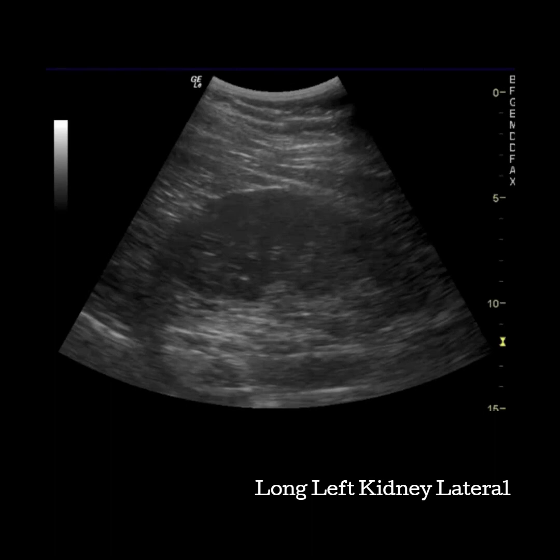Next we're going to switch to the other side and take a look at the left kidney. Ergonomically and window-wise, the left kidney is better seen when the patient rolls up onto their right side facing you. This gives you access to an anterior, coronal, or posterior approach.